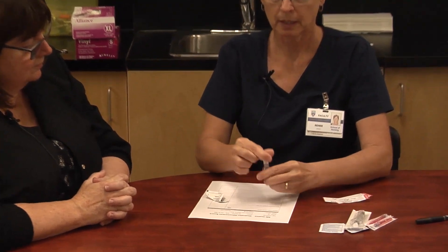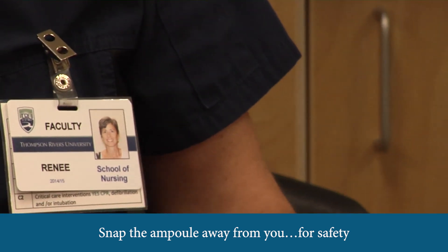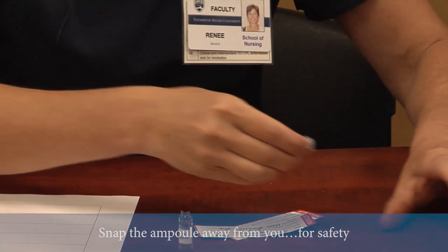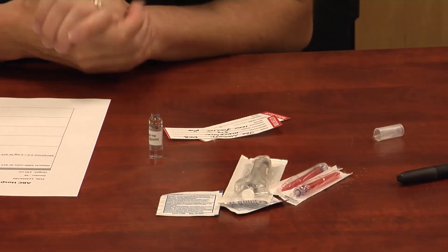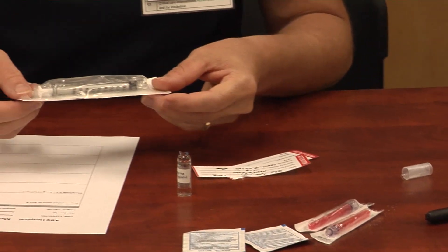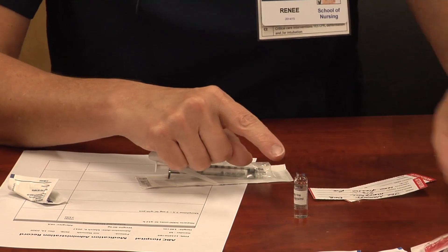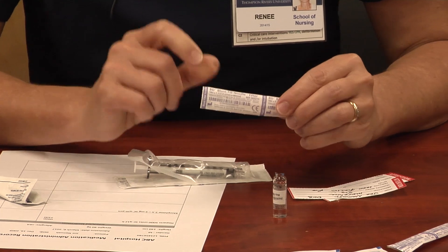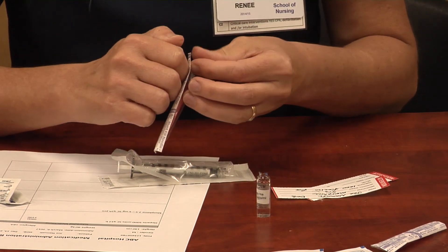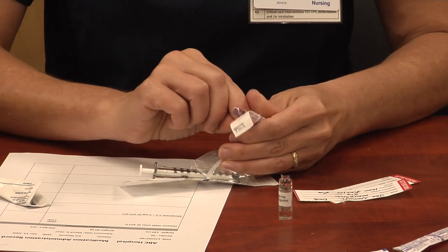I've done my hand hygiene. I'll use my ampoule breaker and snap this away from me — you do it away from you — and sometimes it breaks into multiple pieces, but the ampoule breaker keeps me safe. I've decided I need a one mil syringe because I need half a mil of medication, and because this was an ampoule, I need a blunt fill filter needle so that you don't draw up any glass shards, because the last thing you want is to inject shards of glass into your patient.